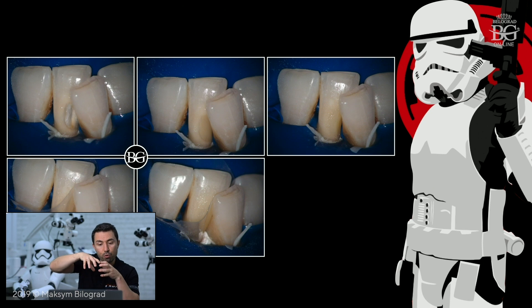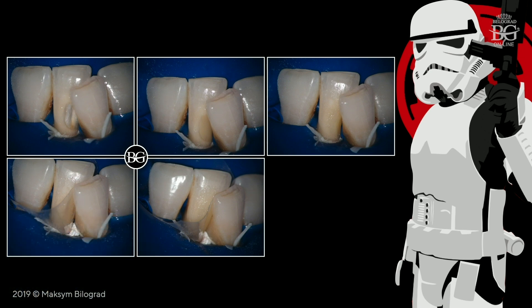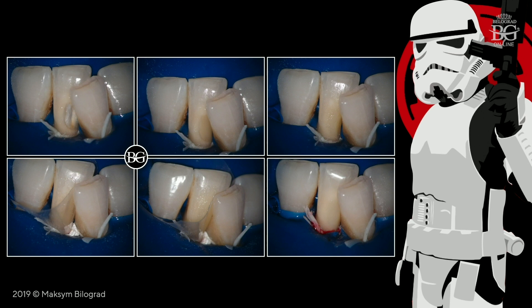Gently and continuously I packed the packable composite lingually — it pushed and forced the flowable composite into the tiny narrow spaces. Then I took the end of the matrix from the lingual side, pressed from the buccal side with a spatula or flat plastic instrument, and pressed the matrix cervically — creating a wedge effect with the plastic instrument. I held the matrix from the lingual side and moved it lingually, and the material followed that movement. This gave me the possibility to create a really smooth emergent profile.